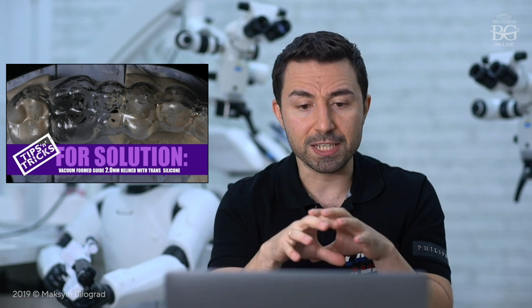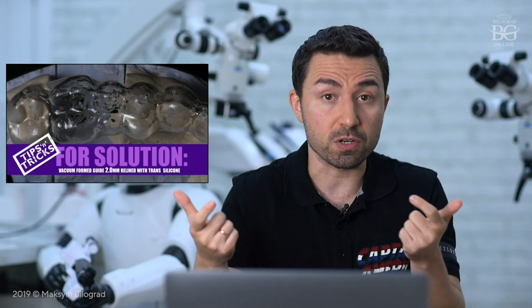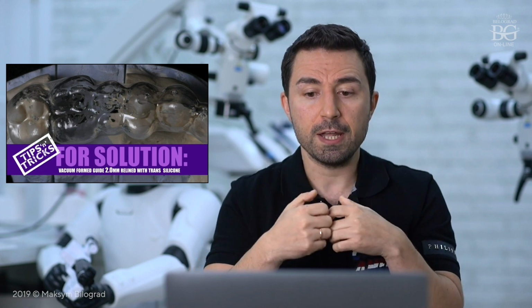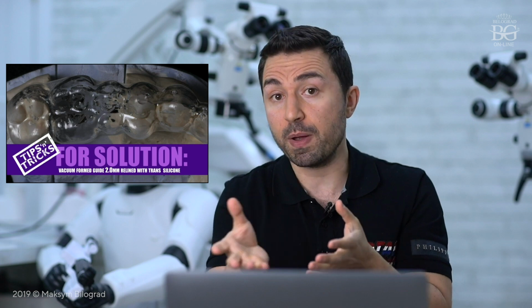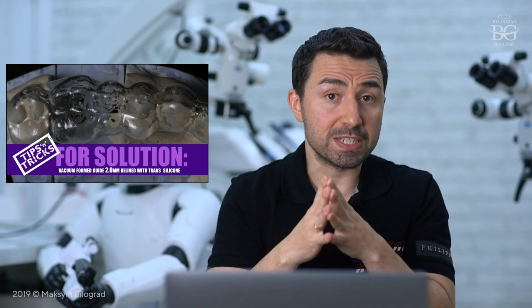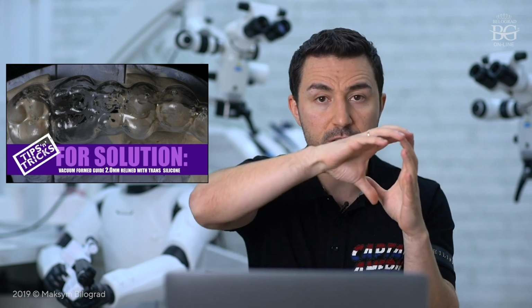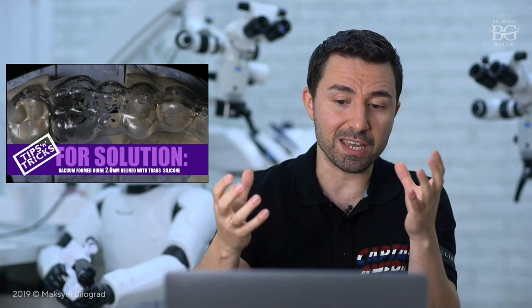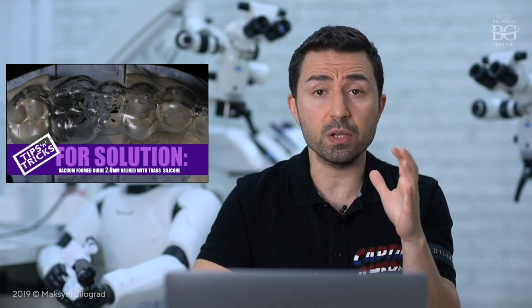Dental technician makes this base, let's say, made of 2 millimeter vacuum formed thermoplastic material, which is pretty rigid, and then we have to reline this material with a transparent silicone. To reline this base with transparent silicone, we can use pretty simple steps. We take this base, this vacuum formed tray, let's say, or guide. We do sandblasting, or the dental technician actually does internal sandblasting with aluminum oxide.